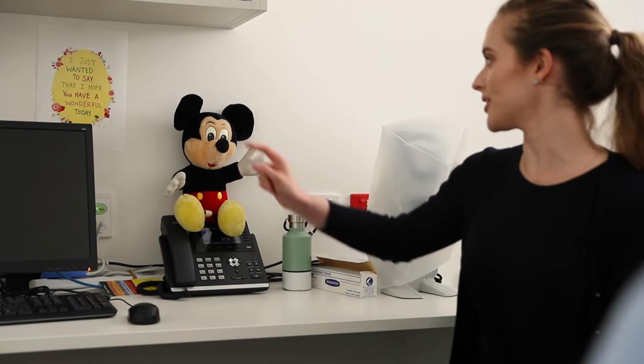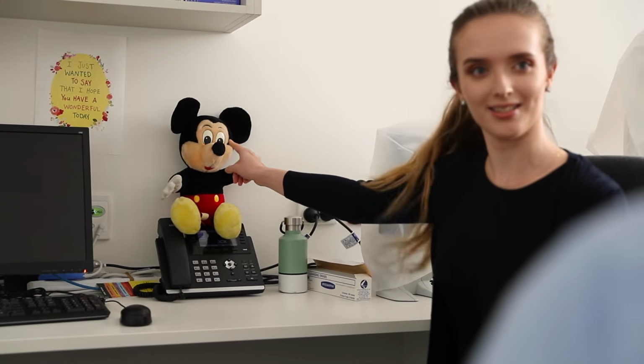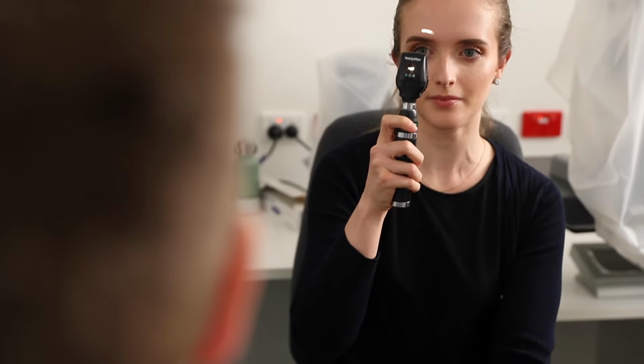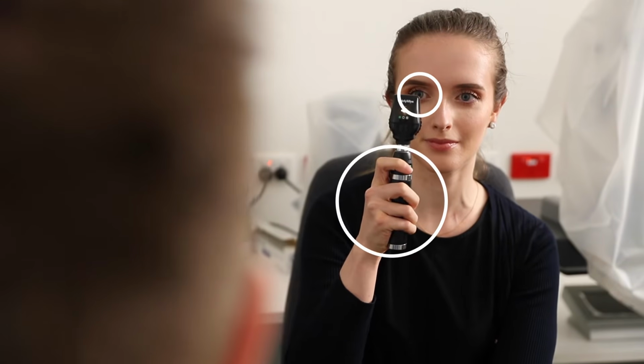Start by giving the patient a specific target in the distance located straight ahead of them. Stay out of the patient's line of sight by standing about 15 degrees to the side. This keeps their eye still and prevents any pupil constriction from the accommodation reflex. To examine the patient's right eye, use your right eye with the ophthalmoscope in your right hand. In other words, line up their right with your right. Similarly, line up their left with your left for their left eye.